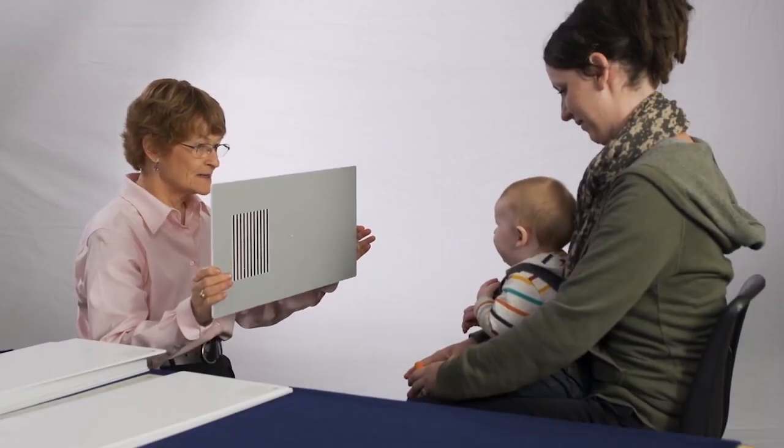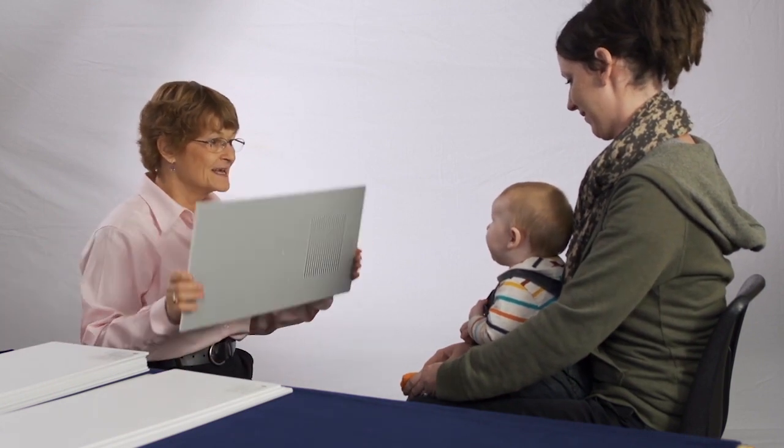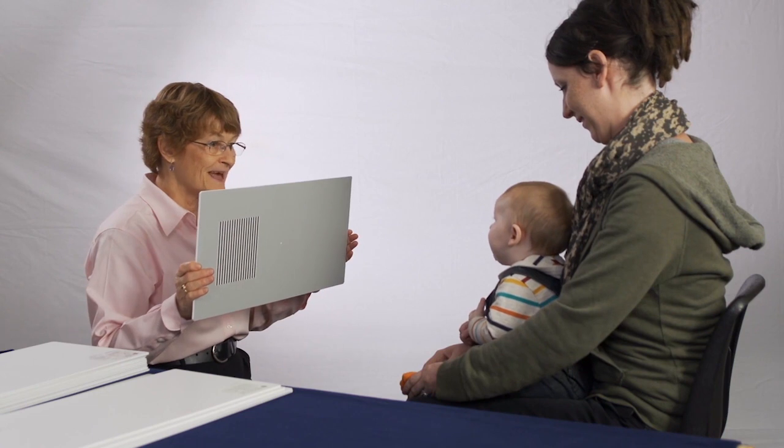The recommended clinical method of testing is for the examiner to present a single grating a sufficient number of times to judge whether the patient sees that grating. As there are only 2 locations where the grating can appear, an examiner has a 50% chance of guessing the correct location without even watching the patient. This means that gratings may need to be shown multiple times if the patient's responses are not definitive.